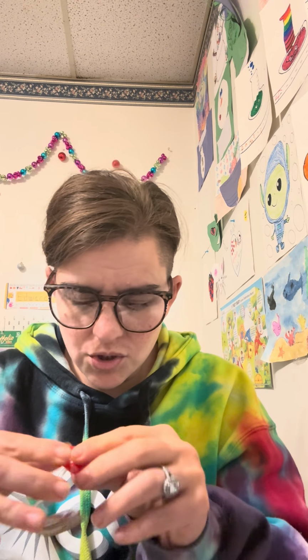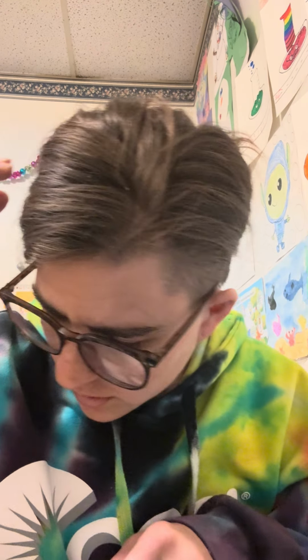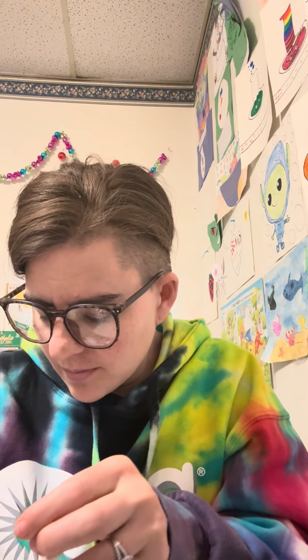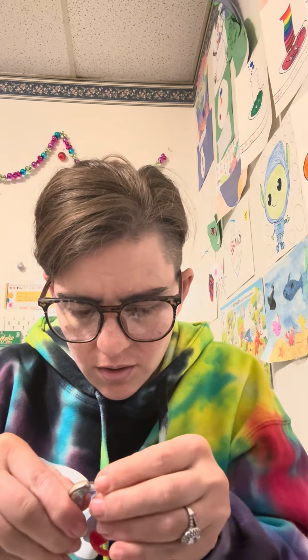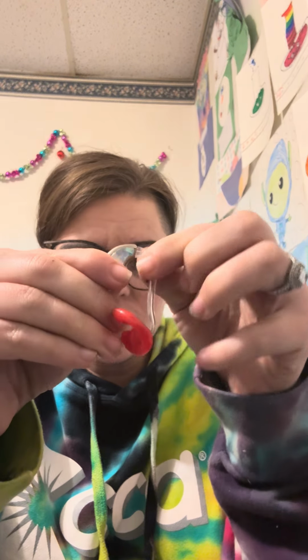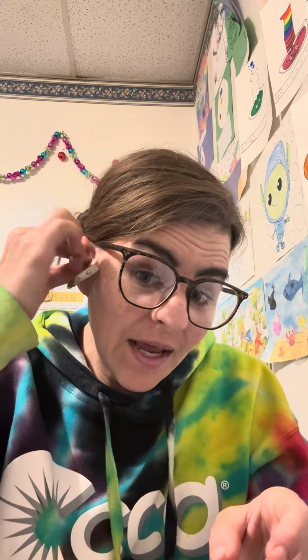So get it all situated, put it in your ear, and then flip it up. Woo! And I didn't get the hook attached. That's why you need to do it on the table, because I didn't get the ear hook fully secured on. So you want to push it on firmly, but don't push too hard, because this is just a piece of plastic. That happens sometimes, which is why I'm glad I did it on the table.